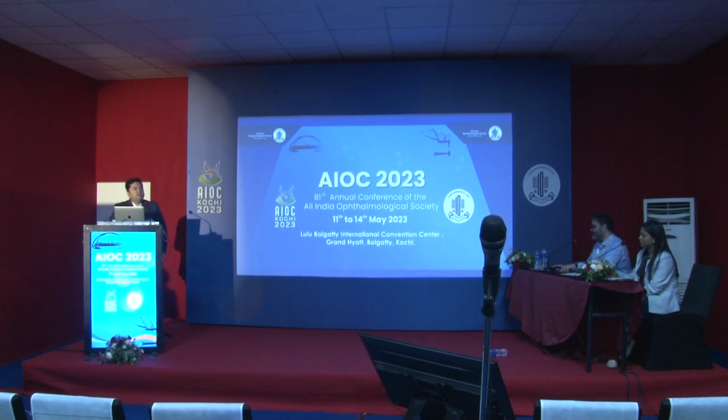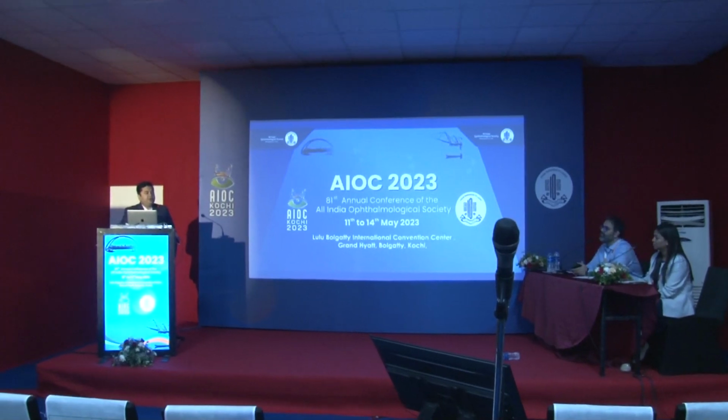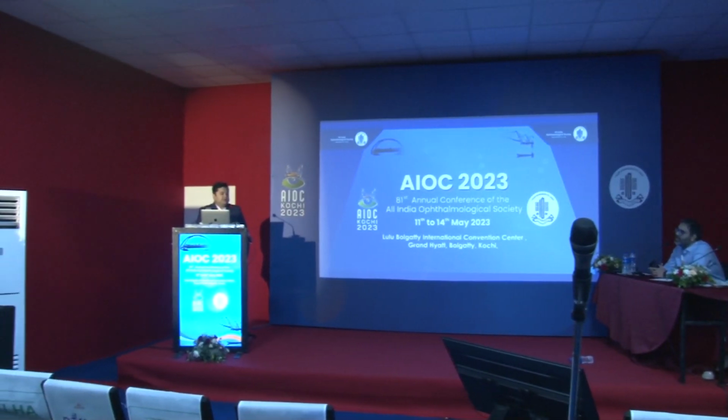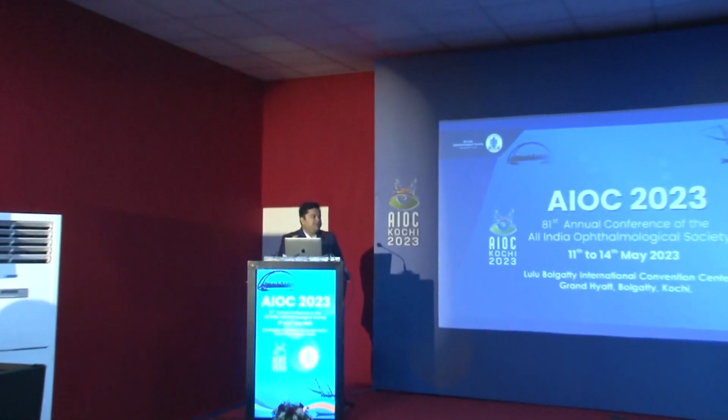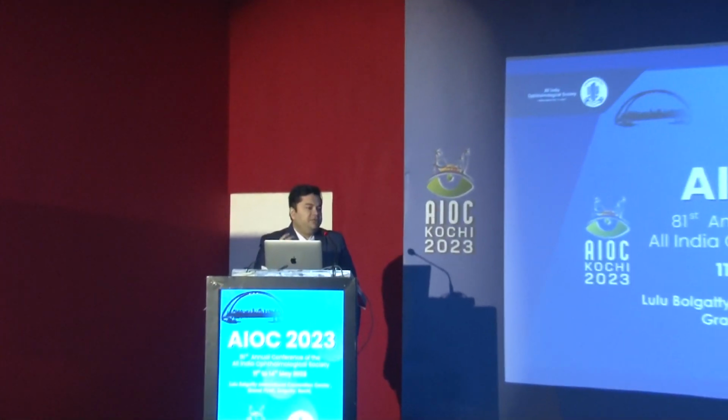Yeah, especially say a young patient post trauma, and you have a subretinal band which is traversing through the fovea, and you have an access to it which is away from the fovea, away from the arcades, and you know that the band is also contracted, it is not going to allow the retina to settle down. So those are the cases where I'll go and remove the band.